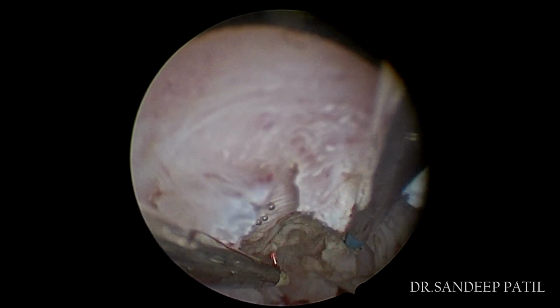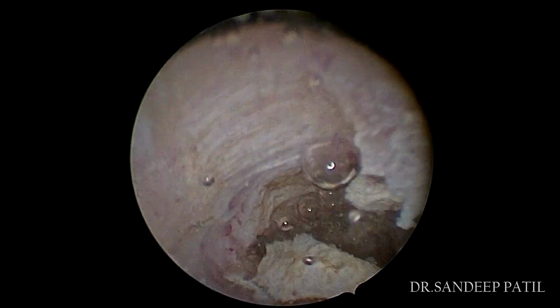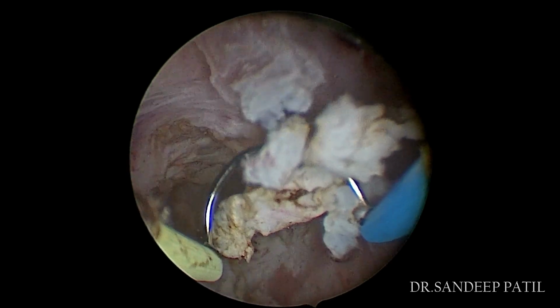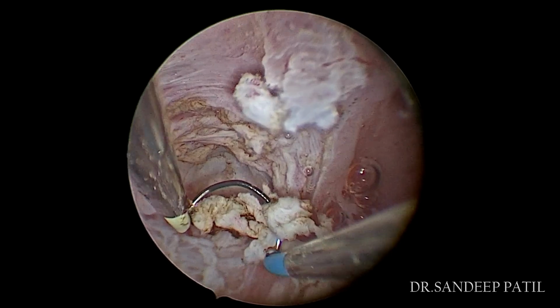endometrium. Bleeding during this surgery is not a good sign. It may suggest that you are resecting into the wrong plane, the fibroid is very vascular, or you are going near the serosal layer, or you have already landed up in perforation.